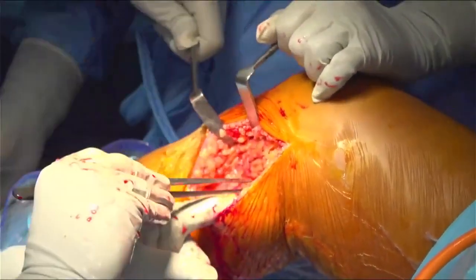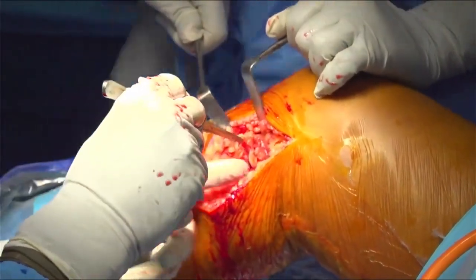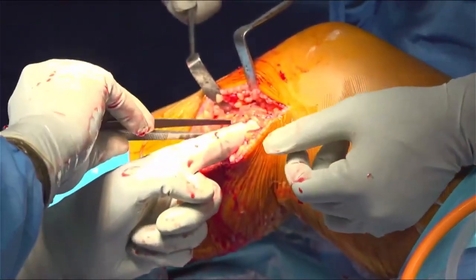So probably, can you hold it like this? So now if you see, my MCL is right here.